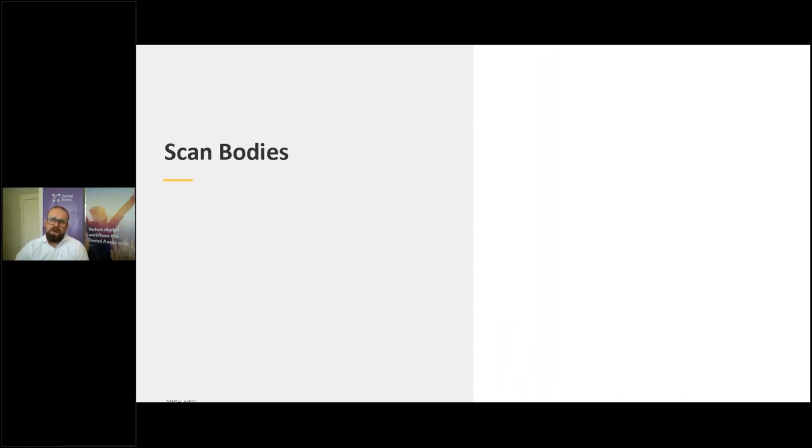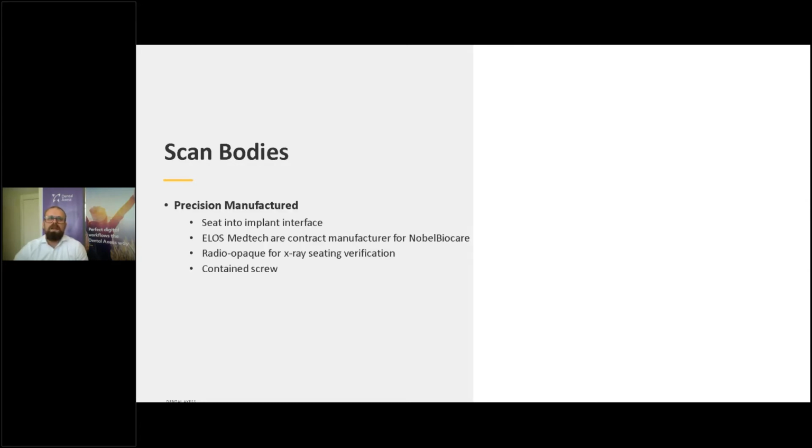And like I said before, we talk about scan bodies. A scan body is very precisely manufactured. It seats into the implant interface.